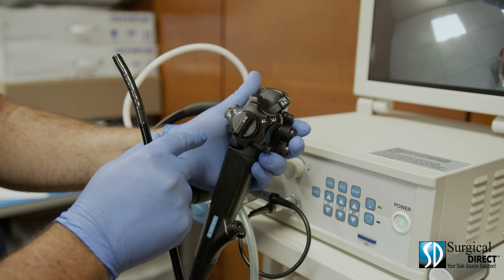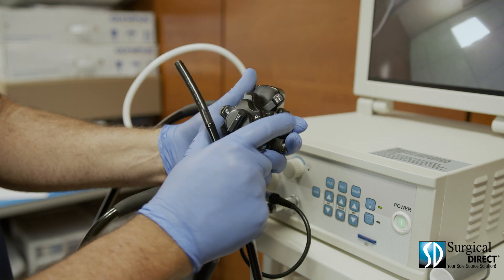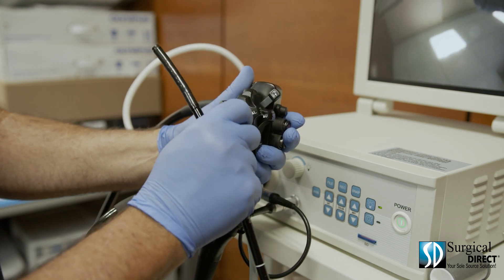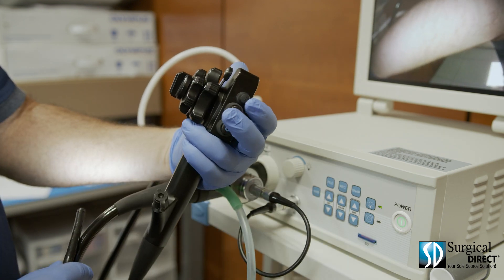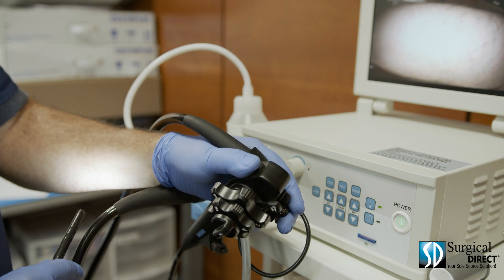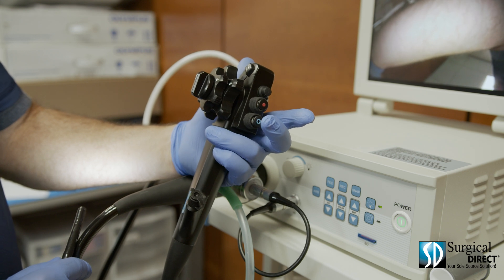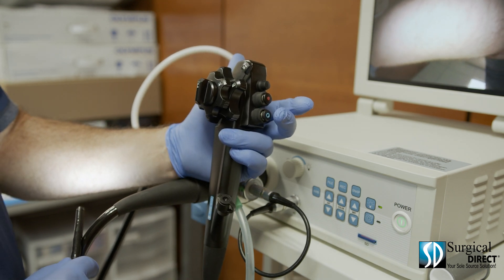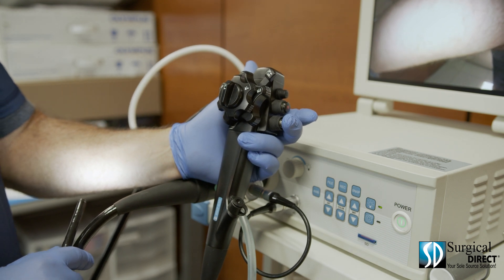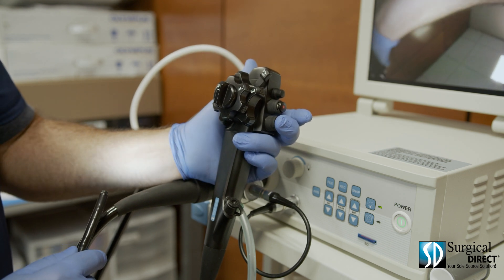On the control body of the scope, you'll find a right-left control knob, an up-down control knob, a locking mechanism for the up-down, and a locking mechanism for the right-left. You'll also find the number one button for taking pictures and the number two button for taking video. The red valve is used for suction. The blue valve is used for both air and water. If you lightly press the blue button without fully depressing it, you will get airflow. If you push the blue button, you will get water flow.